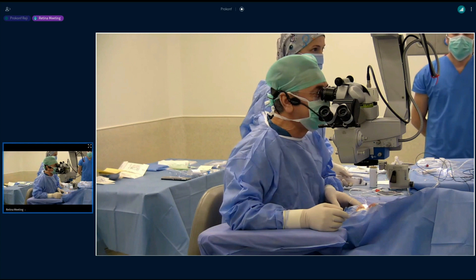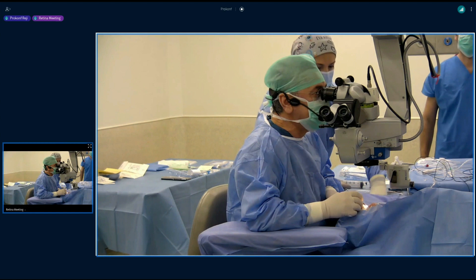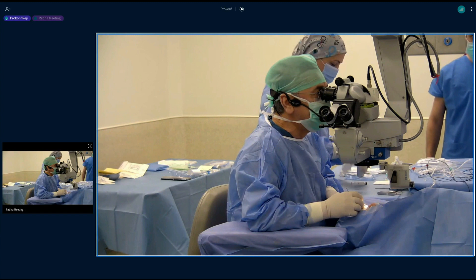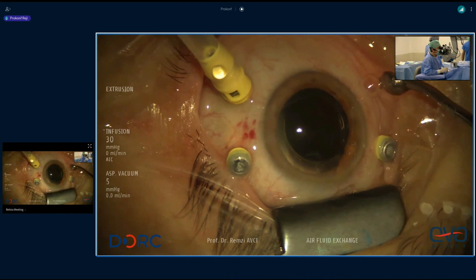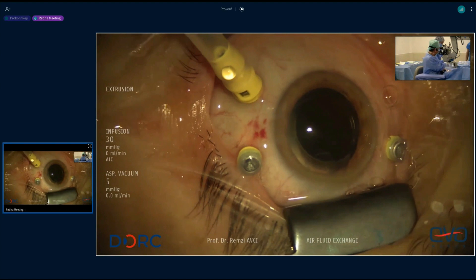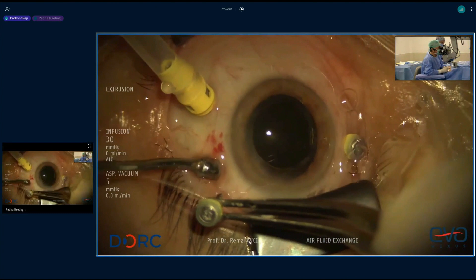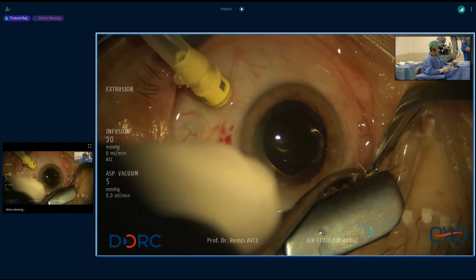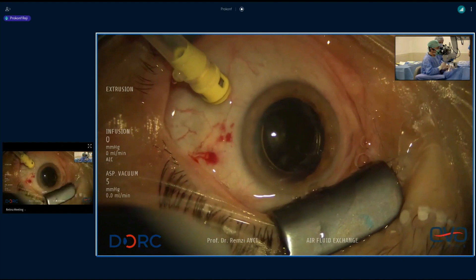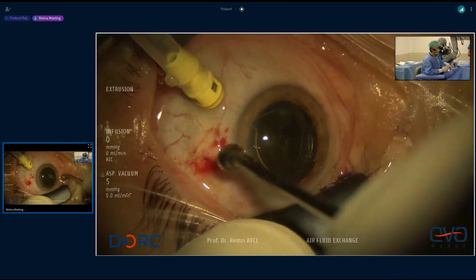We will finish and remove the trocar. Are you leaving just air? Normally I use air alone, but this is a very large hole. Therefore, in this kind of patient, I prefer 5% C3F8 for tamponade and face-down position for at least three to four days. So you're using dilute C3F8 rather than a short-acting gas — is that because of availability? I have only C3F8. I don't like to use different kinds of gas; I just change the concentration to 5% or others. And C3F8 is the least greenhouse-inducing gas of all the gases we've got, other than air.